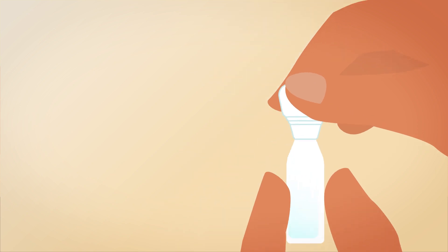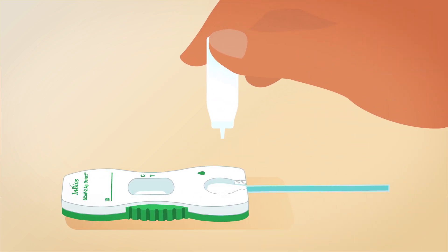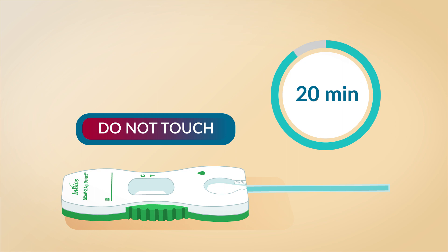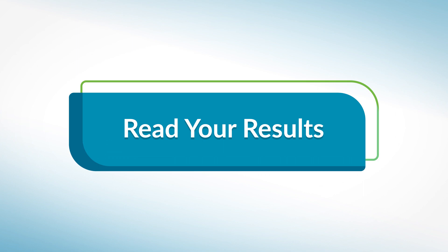Next, twist open the dropper bottle. Hold the dropper bottle straight up and down, one half inch above the swab head. Slowly add one drop at a time until the bottle is empty. Follow the steps in this exact order. Start your timer and leave the test untouched on a flat surface. Come back in 20 minutes to check your test results.